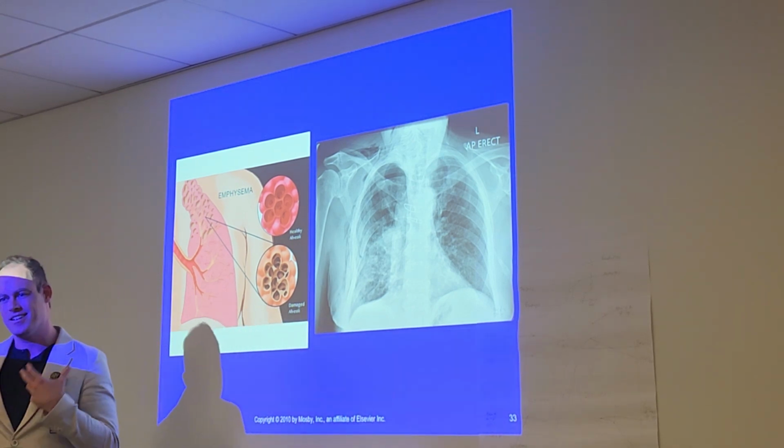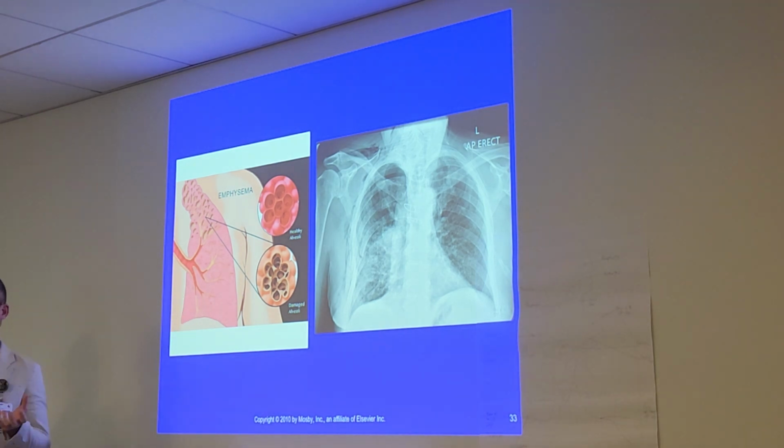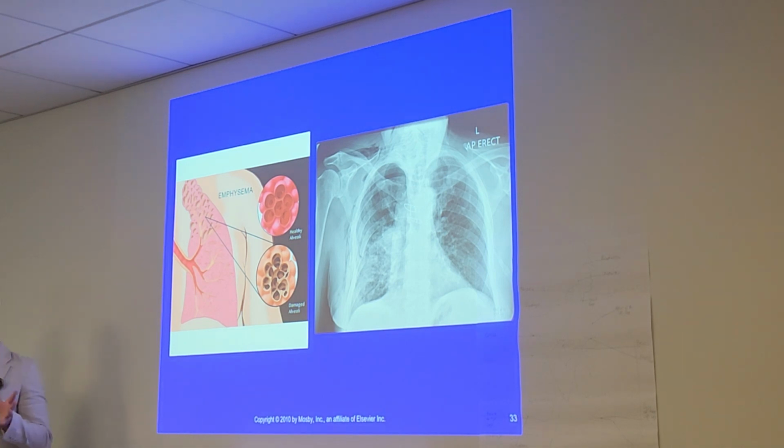It's starting to click. You get that, guys, if you master that concept right there, you're going to answer a lot of pathology questions. Most of your pathology questions revolve around how you adjust your technique in accordance with that pathology. So going back again, atelectasis was what? Decrease. That's less lung, so what do we do with our technique? Increase it because there's less lung that penetrates. Clicking, good? Other than the pathology, is there anything else that's wrong with this patient?